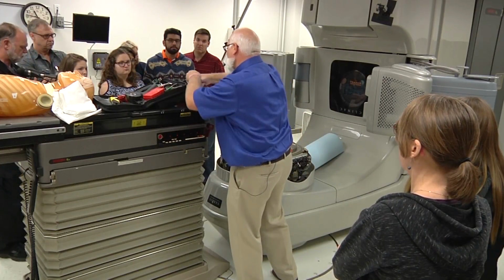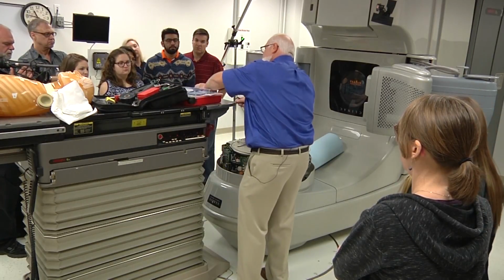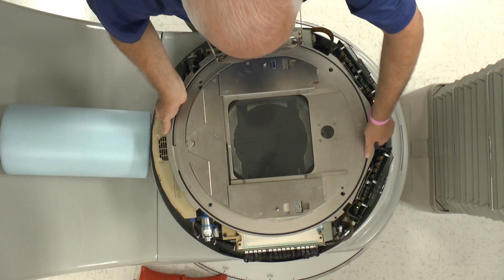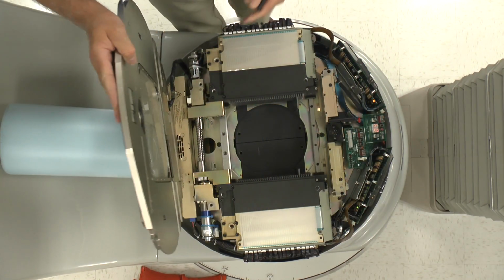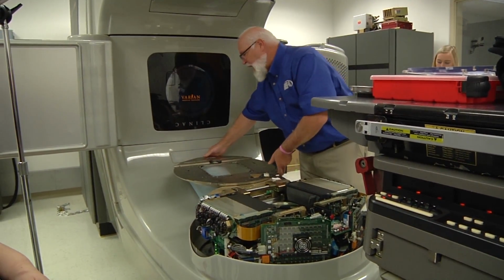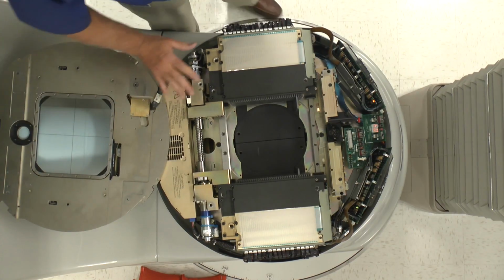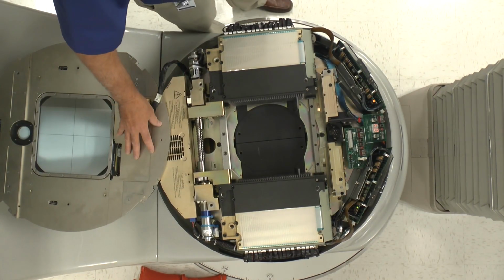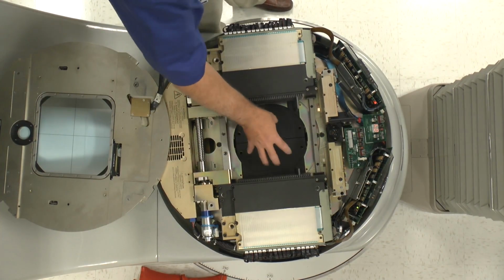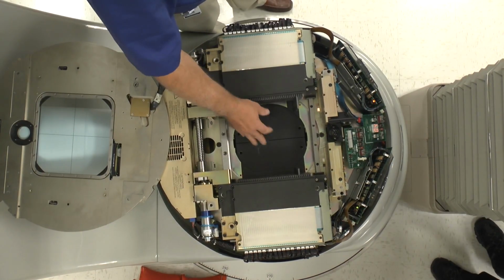I bring myself a little tray so I can stick all my pieces in. So that's why this cushion is here, so we don't damage the fiberglass, keep it nice and pretty, and it just rests perfectly. So now I have this off. Another safety precaution you want to do is close the jaws, because what's below the jaws is that Mylar mirror.